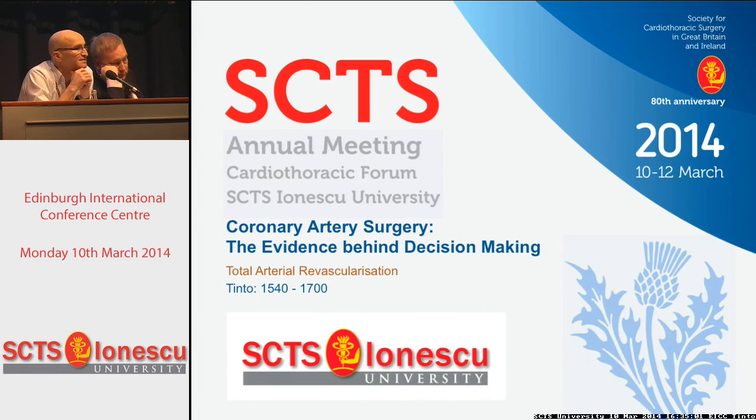Yes. And the other thing is about the venous conduits, of course. Just attaching it to the pump and measuring the flow is another easy way, I think, to assess your graft. But with a vein graft, you can occlude either the toe or the heel and still have flow in one direction, and you won't know about it.